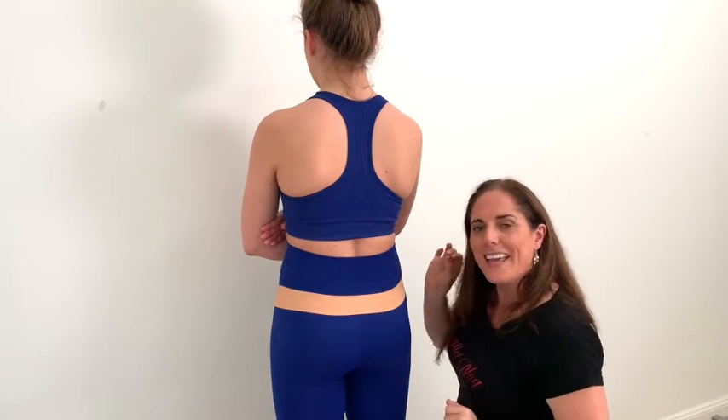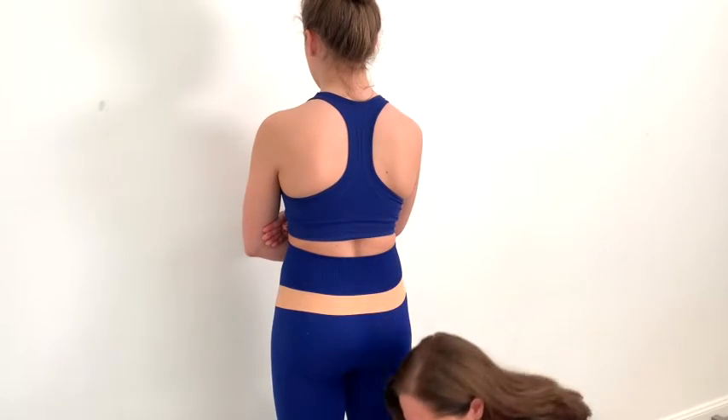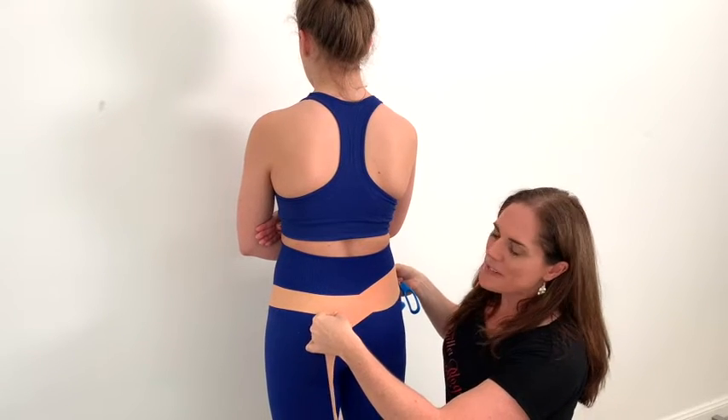If this feels great, go with that. If you feel you need a little bit more support but it's heading in the right direction, you can bring one tape down to the opposite butt cheek.